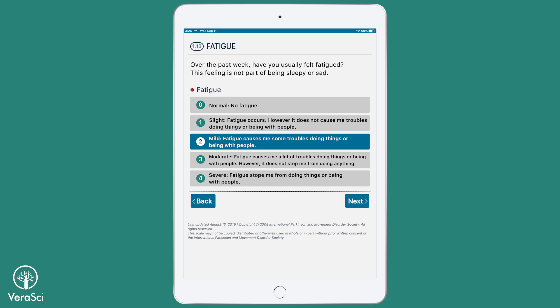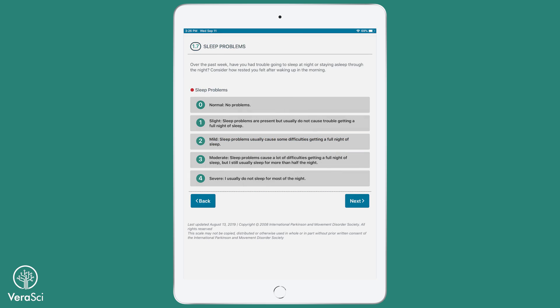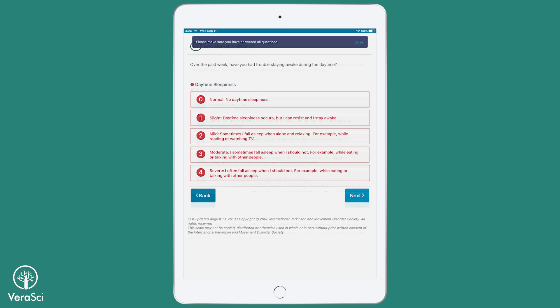The MDS-UPDRS, as it is performed on Pathway, requires that certain items be completed before the clinician can progress in the assessment. The device will provide a warning message to the subject or informant if they attempt to navigate away from a page without completing these required items.